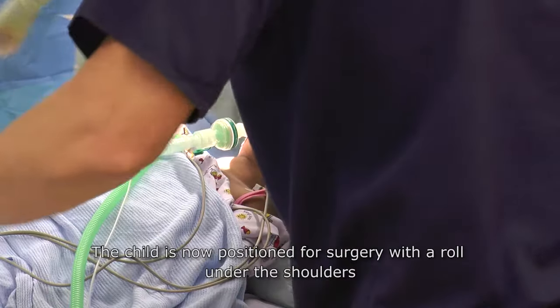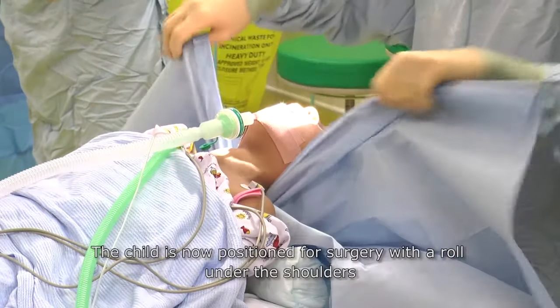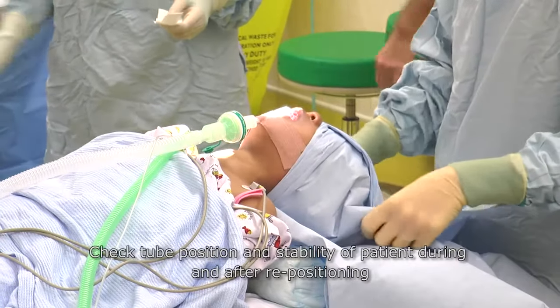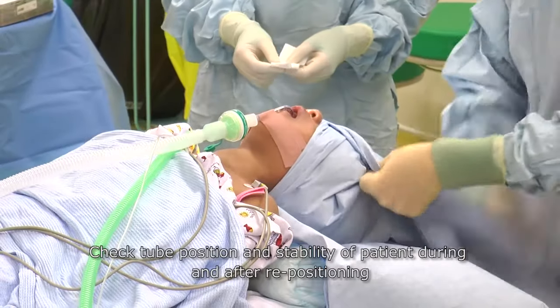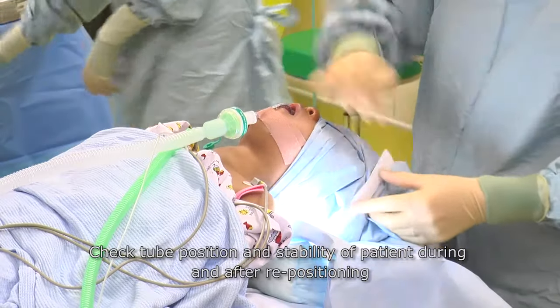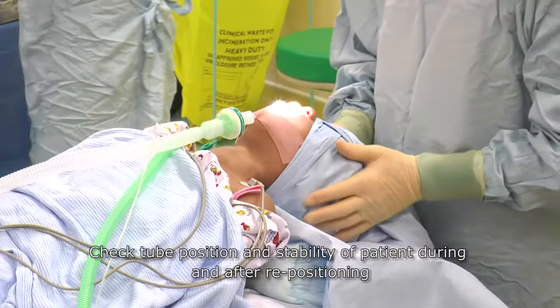The child is now positioned for surgery with a roll under the shoulders. Check tube position and stability of patient during and after repositioning.